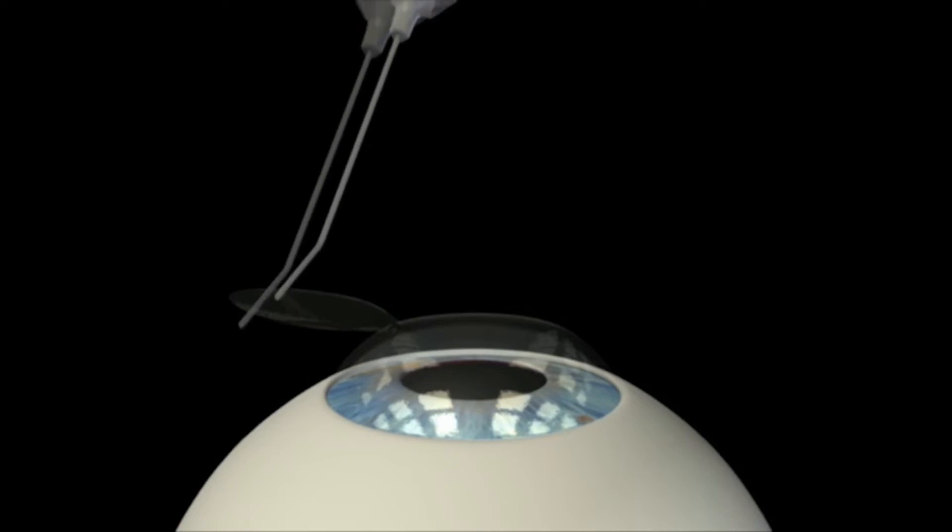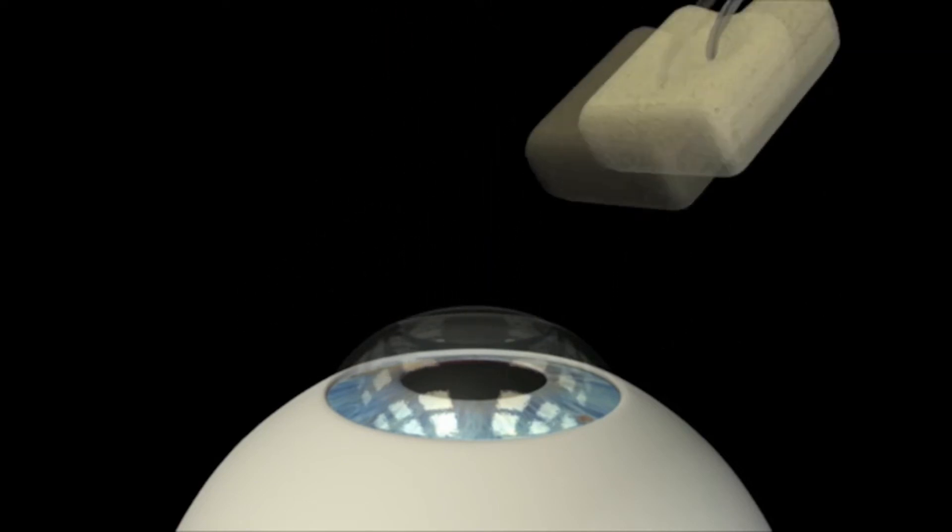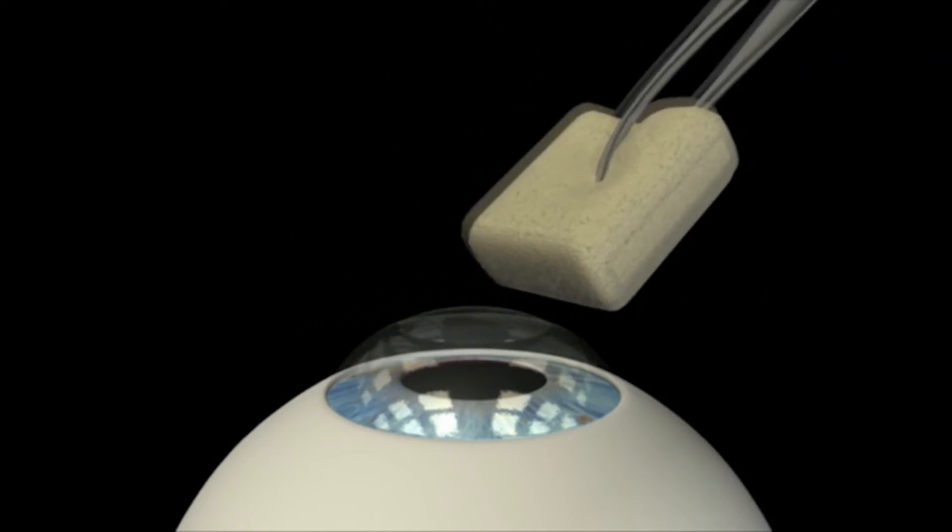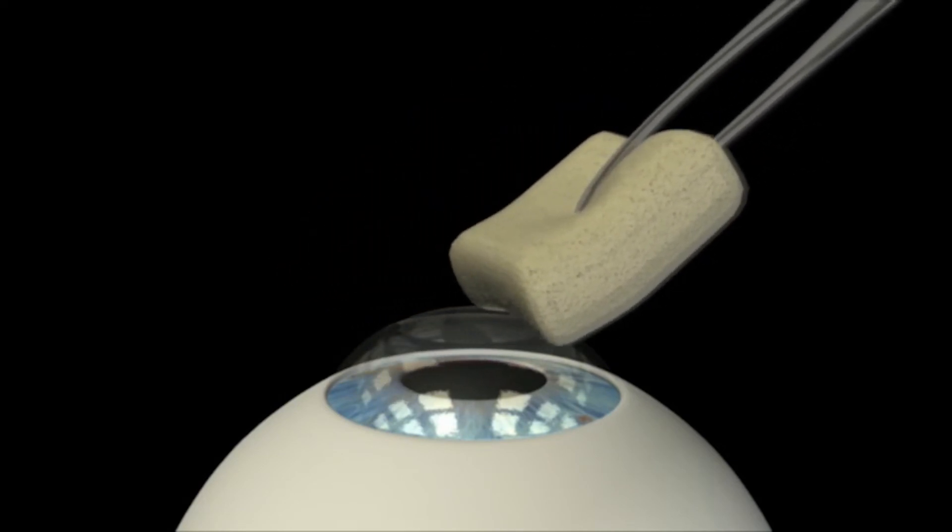The whole laser process only lasts a few minutes, after which the flap is returned to its original place and smoothed with a medical sponge, removing wrinkles and gas bubbles.